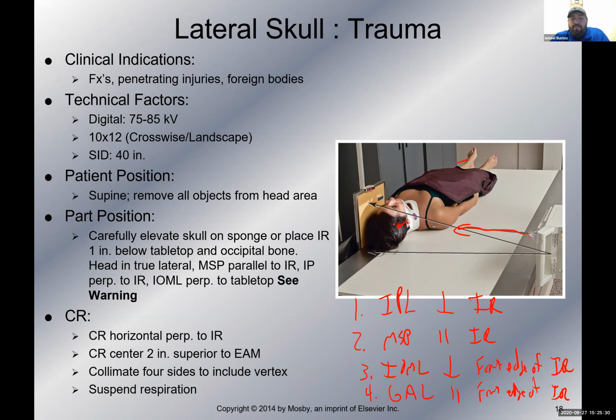All right. Now remember, that is for normal skull morphologies, right? If we have a longer or wider skull, then you need to center midway between the glabella and the external occipital protuberance, or the bump in the back of the head. Okay. That is on page 589.